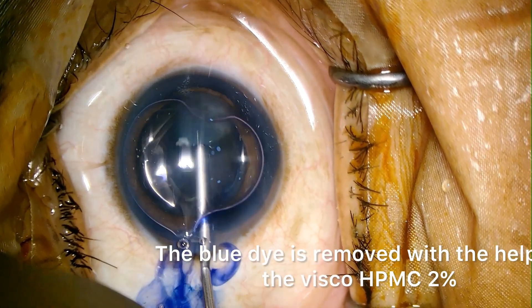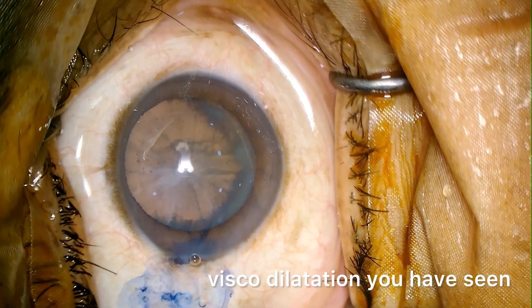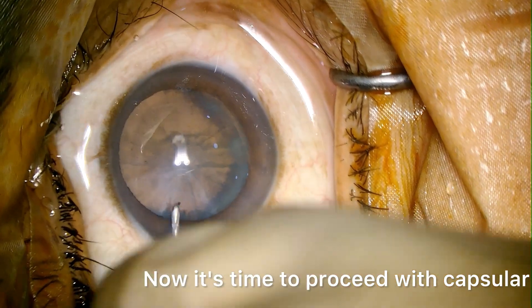The blue dye is removed with the help of the visco HPMC 2%. The viscodilation you have seen. Now it's time to proceed with capsulorhexis.